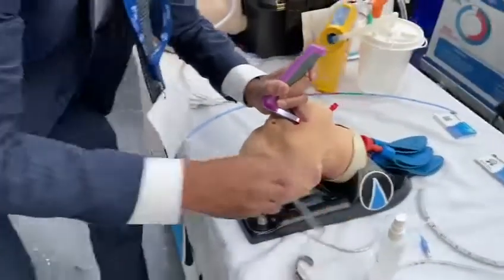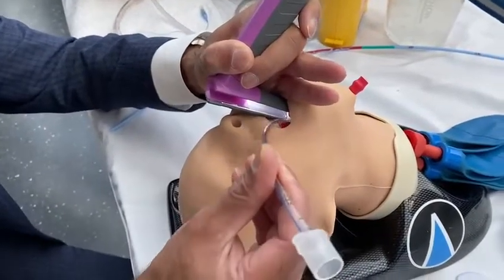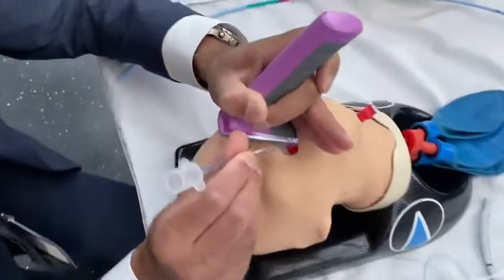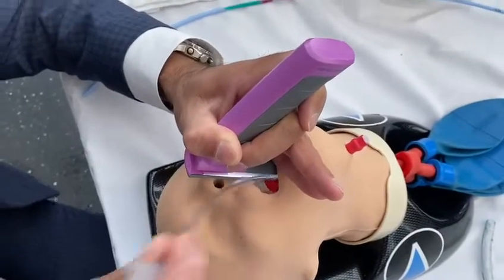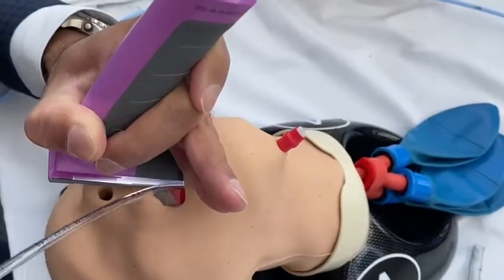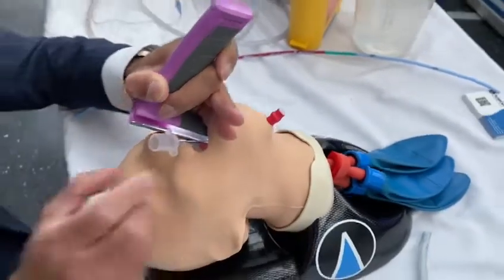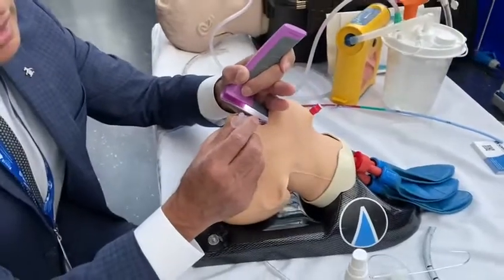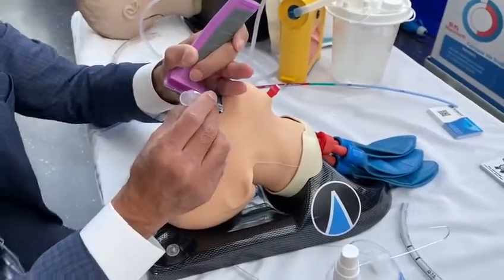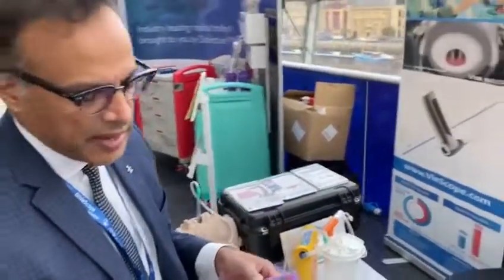The key here is to pass the tube from the side. There's a sideward action right at the corner of the mouth and try to minimize the distance. There's none of this business coming up from the top of the scope — it's from the corner here, passing under direct vision straight between the cords. And you can use the age-appropriate endotracheal tube. This is a very easy intubation to perform with the device.